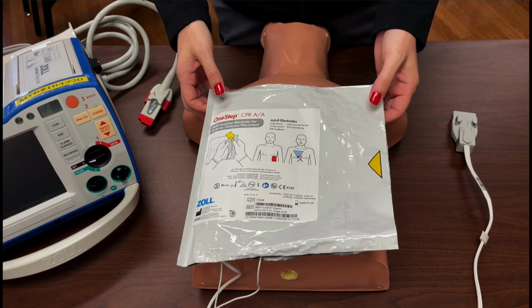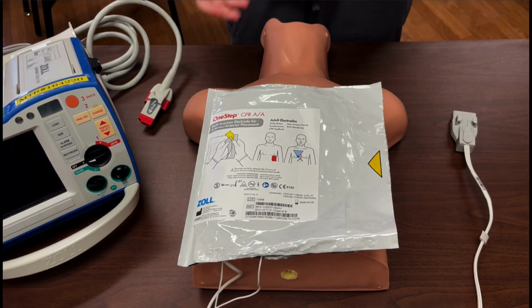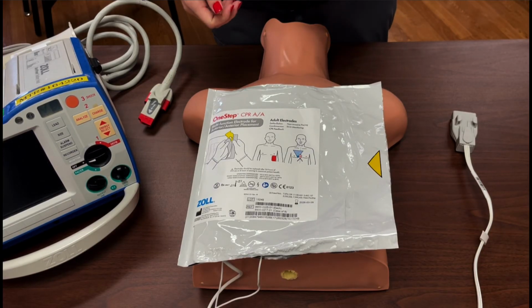So the pads are going to be anterior pads. They'll be across the patient's front. There are some scenarios where you can use the pads in an anterior posterior fashion, and these would be if you need to cardiovert a patient or pace a patient.